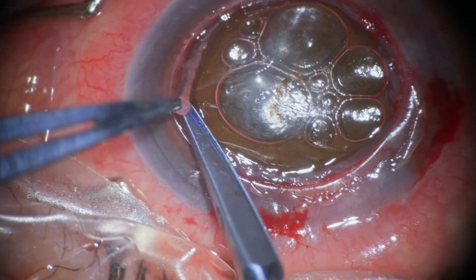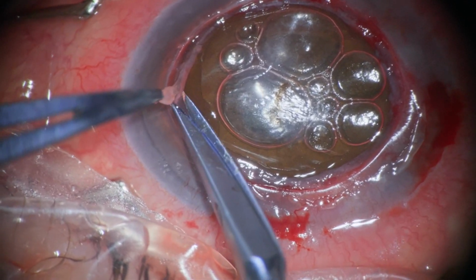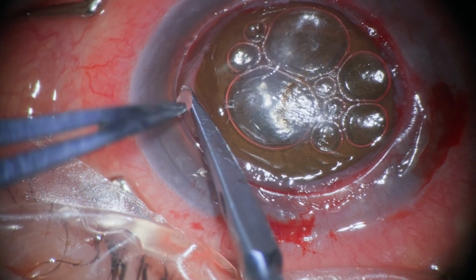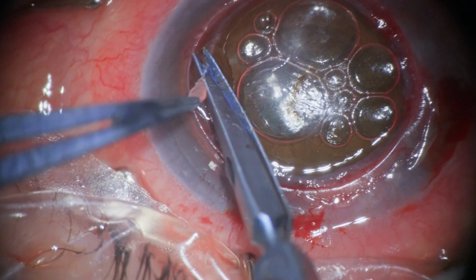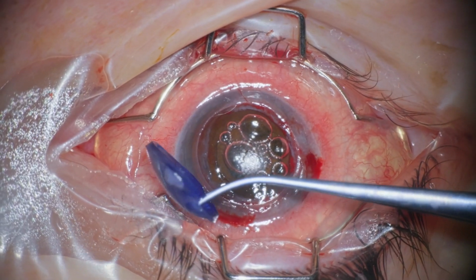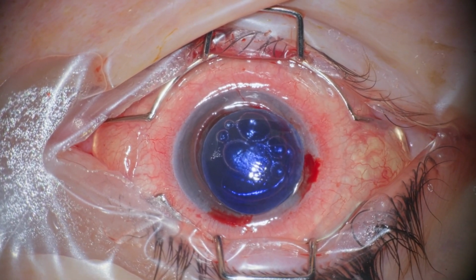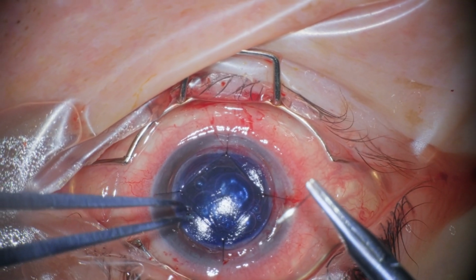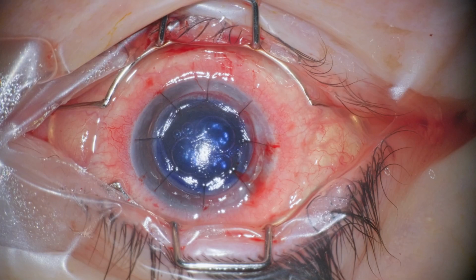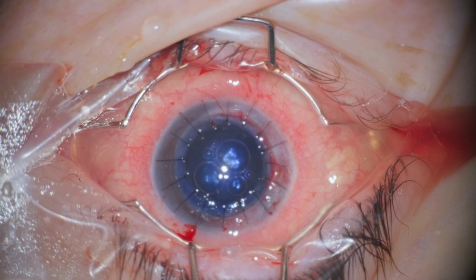It would be a pity to sacrifice Descemet's here, so it's our intra-op decision to keep the patient's endothelium and try to do phacosurgery with or without DMEK later on in this patient's course, because anyway she's going to be better off like that rather than doing a PK right now. Thank you for your attention.